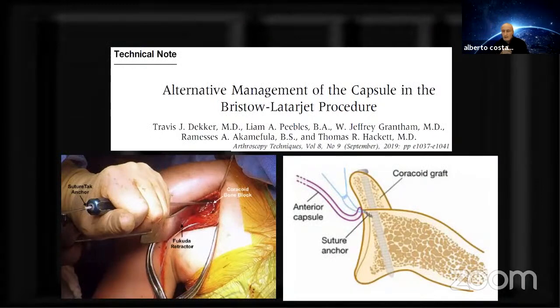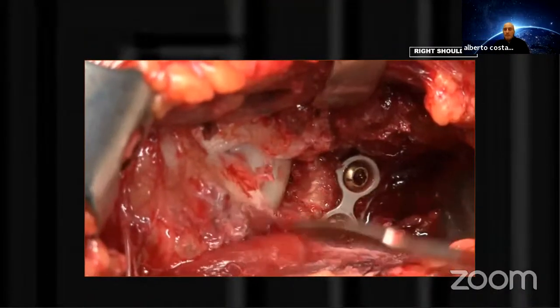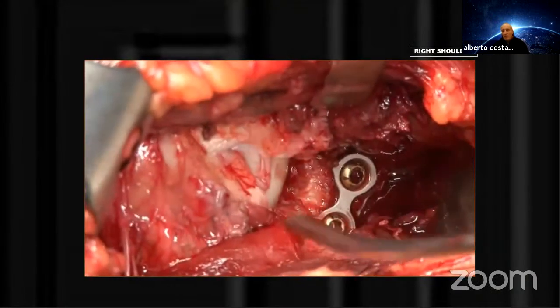This is just, to come back at the end, to the capsule. Before closing the graft, we can put a small anchor and reattach the capsule. This is important, especially in the case in which we have much laxity or very distracted soft tissue, or when there is not much bony defect, because in this case we put too much stress on the anterior capsule because we medialize too much. And this is the aspect after surgery.